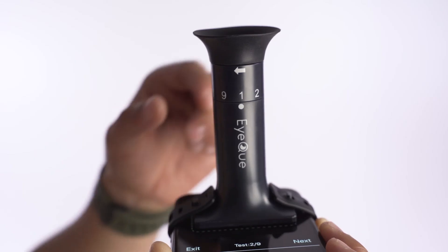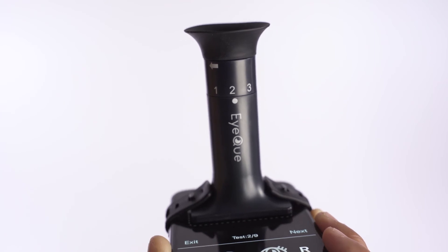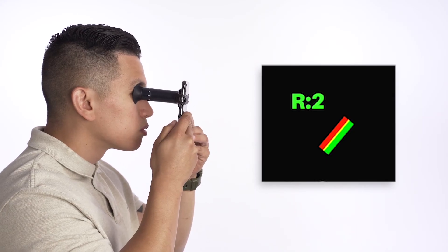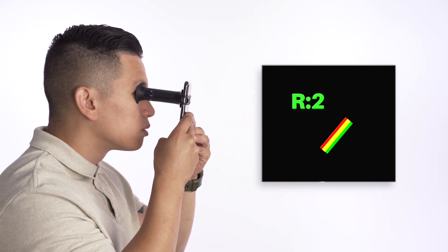Rotate the eyepiece to Position 2. When in Position 2, you'll feel a soft click. You should then see R2 while looking through the device, along with the red and green lines now at a tilted angle.